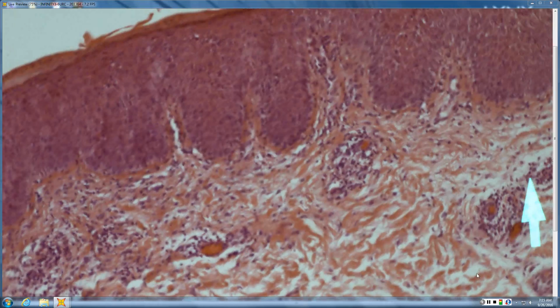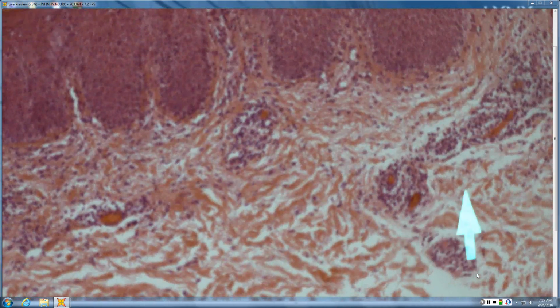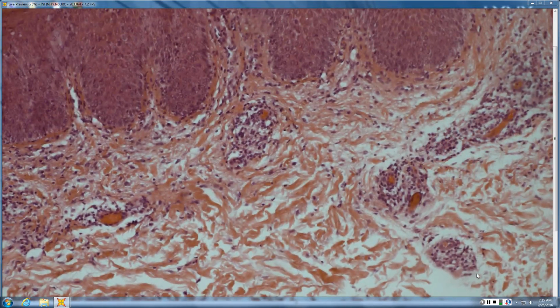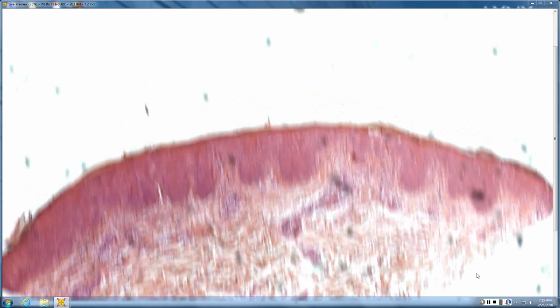And then all you have here is just a kind of medium perivascular infiltrate that's predominantly lymphocytic. We would normally hunt around and see if there's any eosinophils at all, because maybe that helps justify, like, oh, it's allergic contact dermatitis or a bug bite or something of that nature. But this really just brings up a differential. A very unsatisfying result.